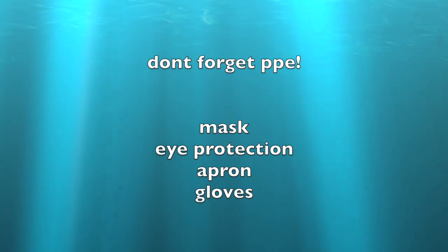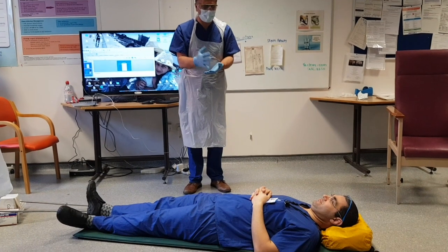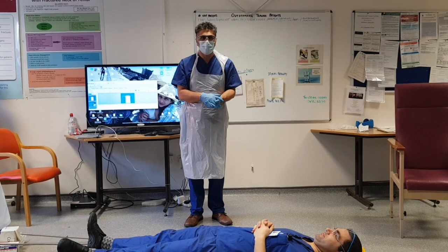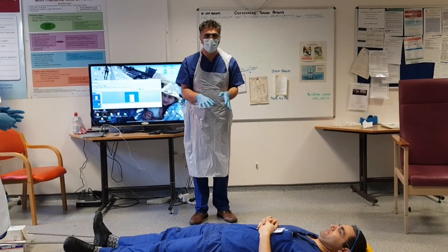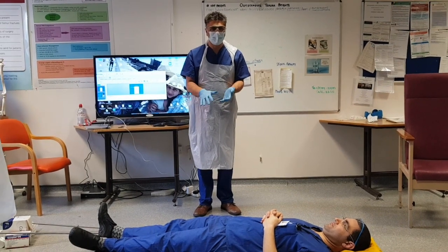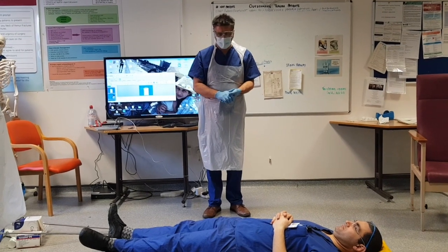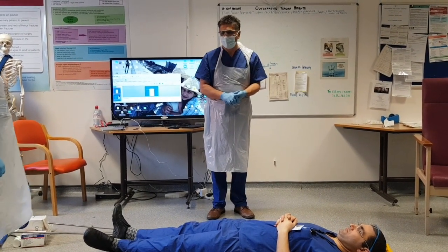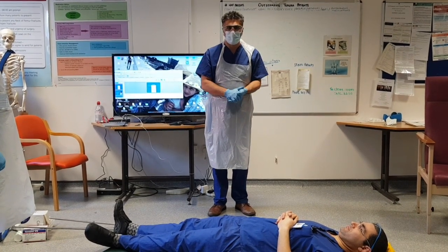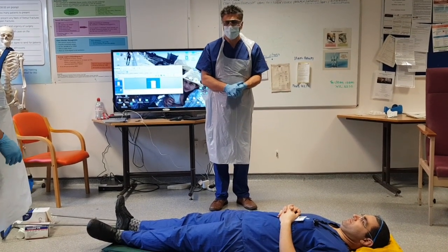Don't forget to use personal protective equipment at all times. For the purposes of this demonstration, we're going to assume that Kareem has got a left femoral fracture and his ATLS has been done, so his airway, breathing, and circulation will be fine. What we need to do first of all is make sure that he's comfortable, and normally I give a femoral nerve block in order to make sure that he's not in too much pain while we put on the Thomas splint.